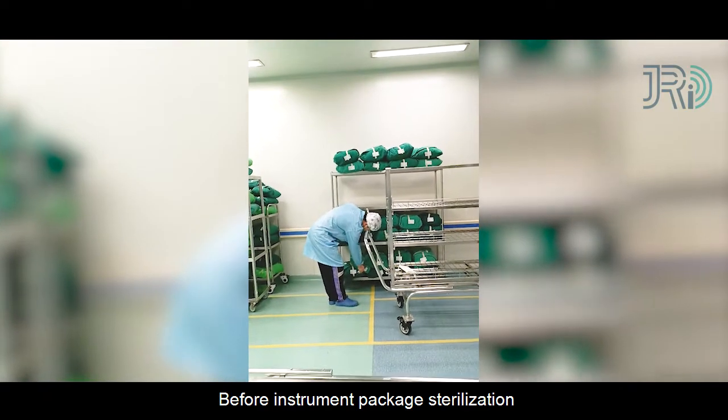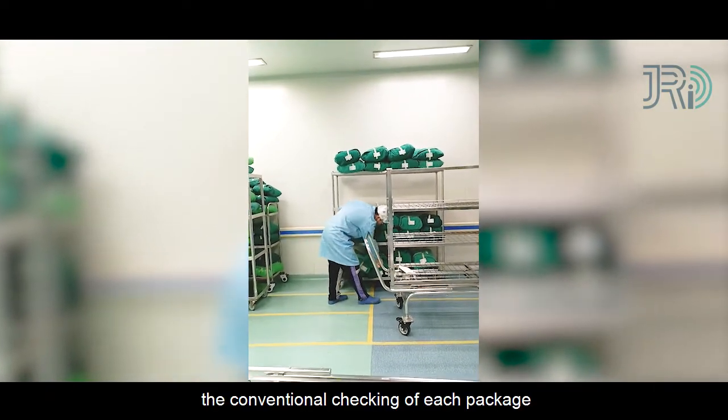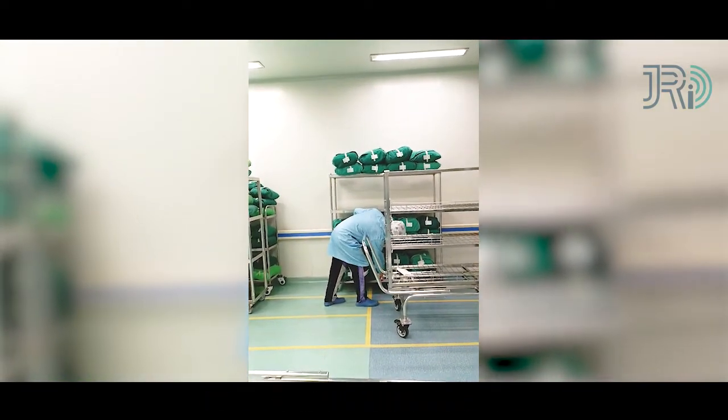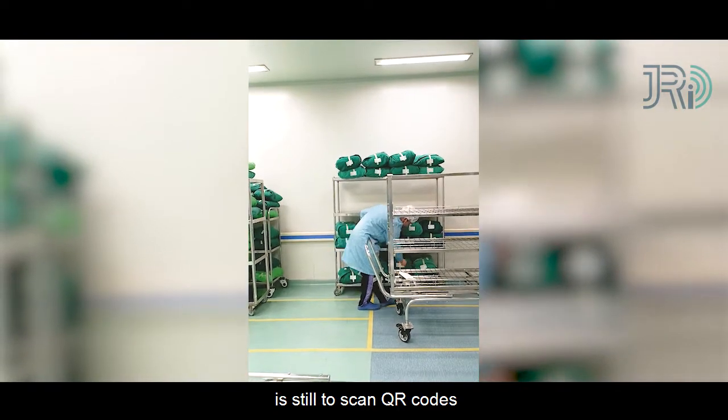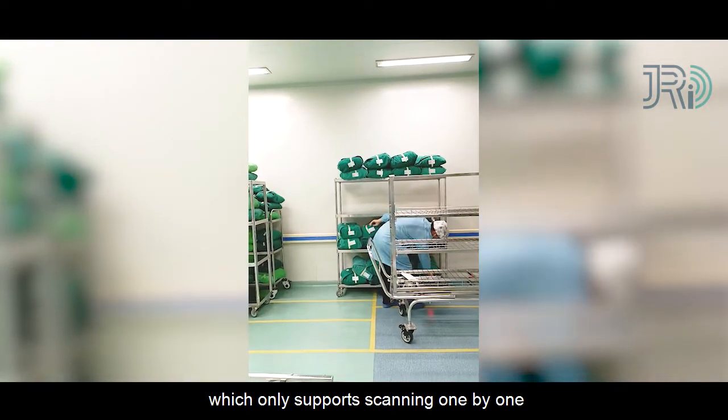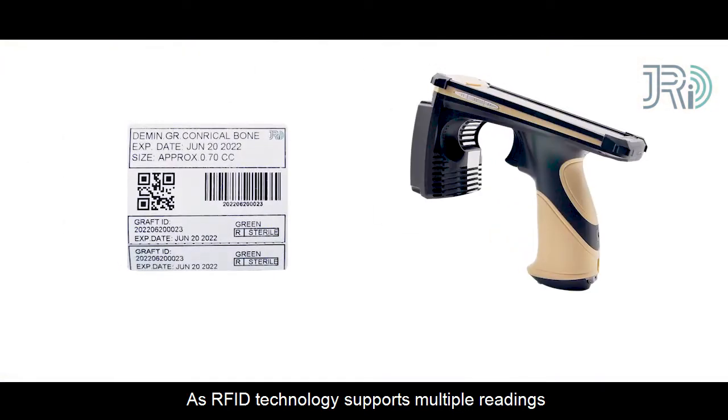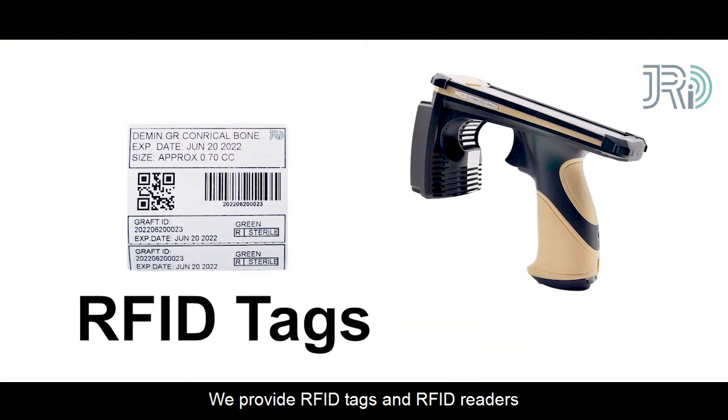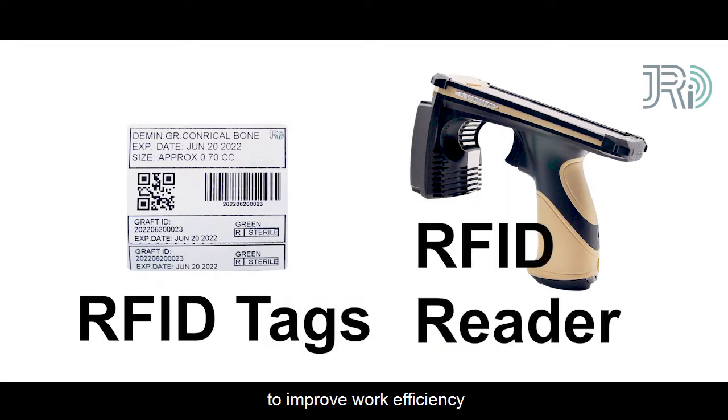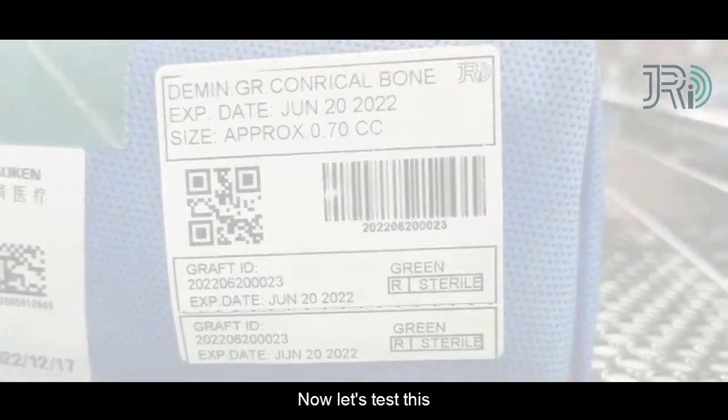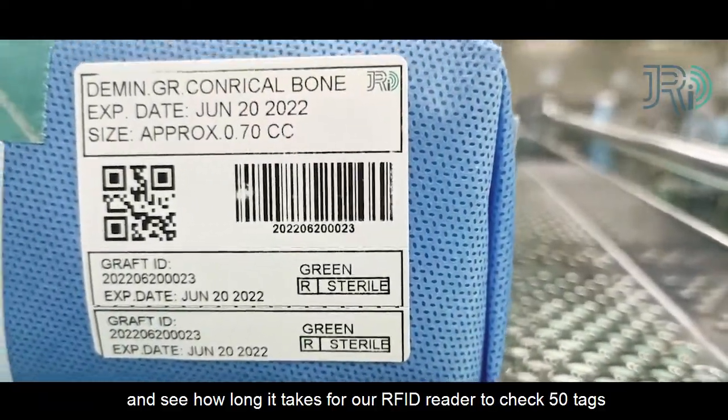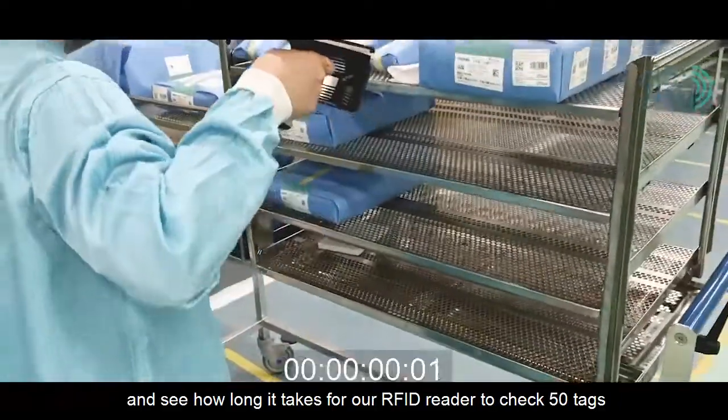Before instrument package sterilization, the conventional checking of each package is still to scan QR codes, which only supports scanning one by one. As RFID technology supports multiple readings, we provide RFID tags and RFID readers to improve work efficiency. Now, let's test this and see how long it takes for our RFID readers to check 50 tags.